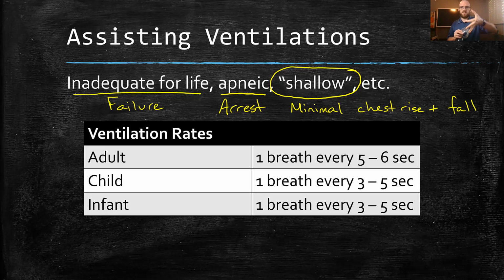Right? The C, of your thumb and index finger, holds your mask. The E is your remaining three fingers, and those three fingers help lift the jaw up. So it's the CE grip. C for the mask, E for the jaw to help stabilize it and hold it onto the jaw there.